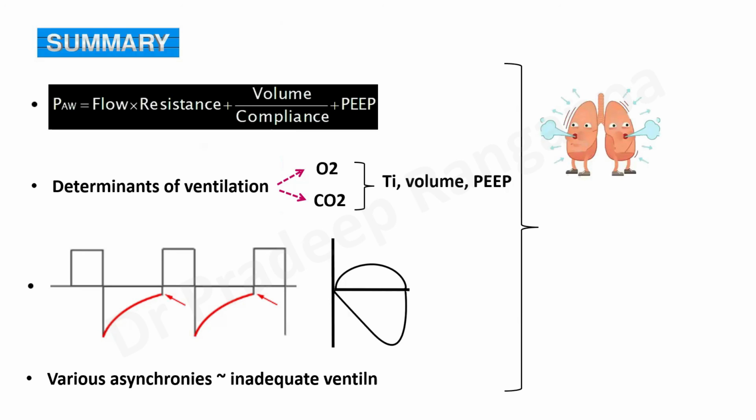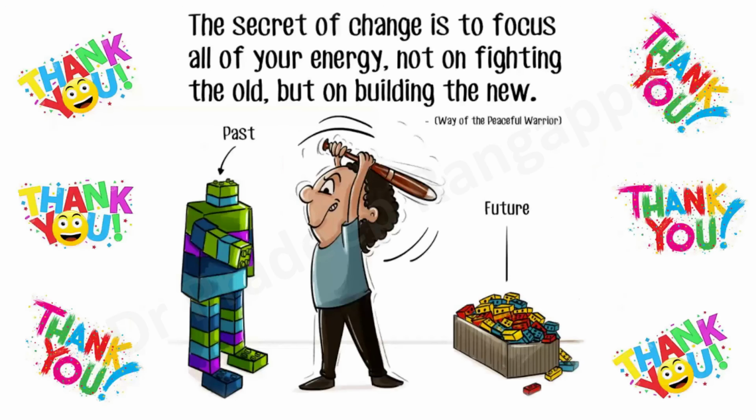And what does all this have bearing? All this, if not appropriately done, puts enormous stress on the lung, and it increases your respiratory effort and your respiratory muscle effort. And together with lung stress and respiratory effort, your transpulmonary pressure goes up, your transpulmonary driving pressure goes up, transpulmonary peak pressure goes up, and that can produce VILI, ventilator-induced lung injury. So it's underventilation that can produce P-SILI, patient self-inflicted lung injury. So this is our summary understanding of this whole flow dynamics on ventilation strategies.